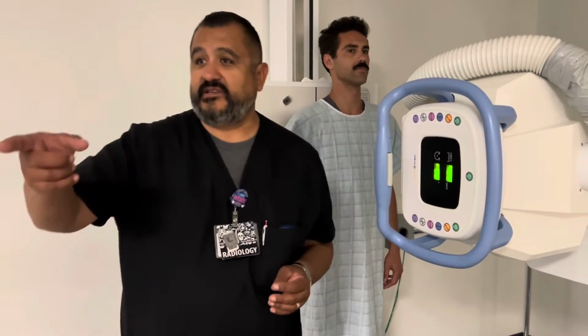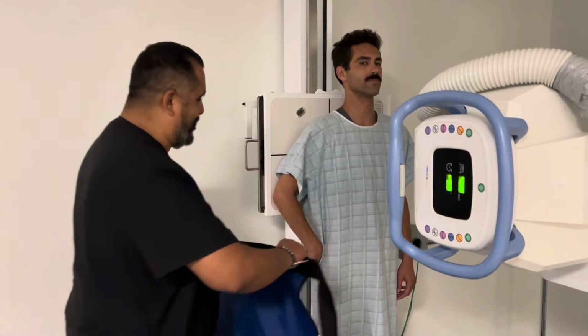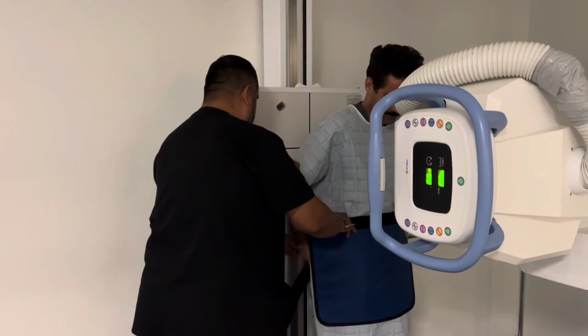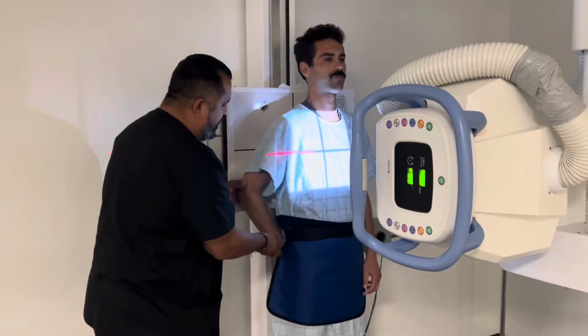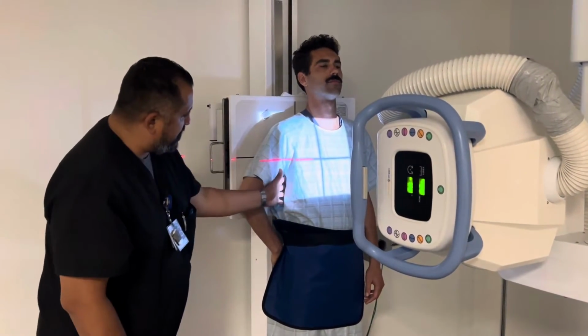So if I can have a shield, I just saw that too as well. Thank you. All right. Can't forget about this. Let's put this around your waist. Meet me around the corner. All right. Make sure it's a little tight, just like that. All right. And these things happen again, you guys. So, you know, it's an easy fix. He's not too far in the position that we have him.